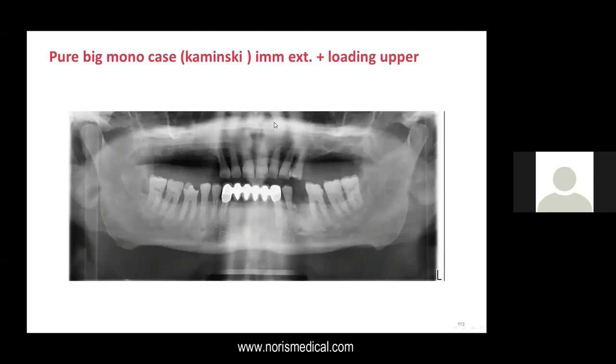This is actually a big mono case. If we go out of the frame, so here are the teeth of the patient. Of course, he expects an immediate solution. This patient weighs something like 120 kilos. Of course, he promised me that he will eat very gently, but I knew that, and he is really, really afraid of dentists. So here I had a very good opportunity to treat him.